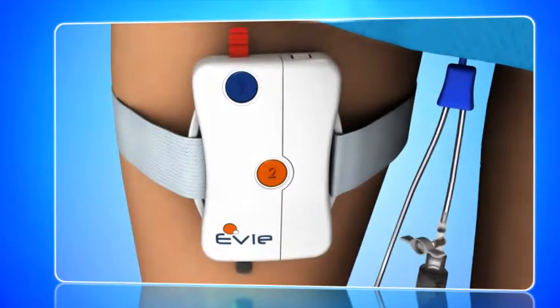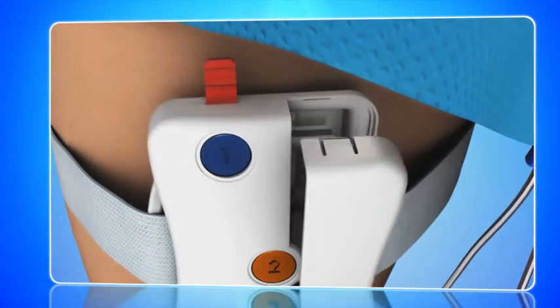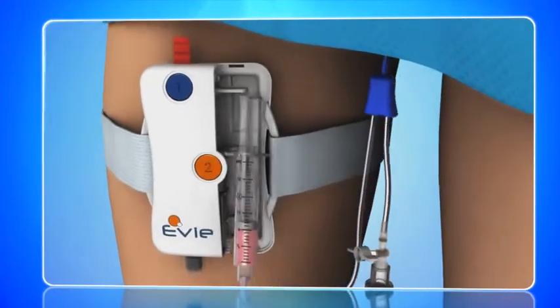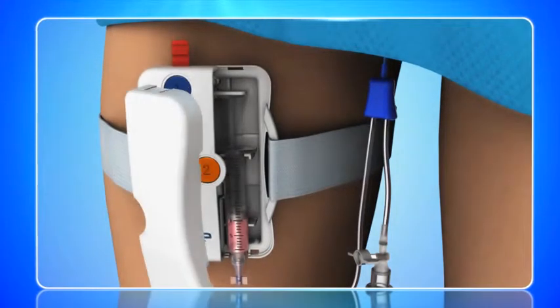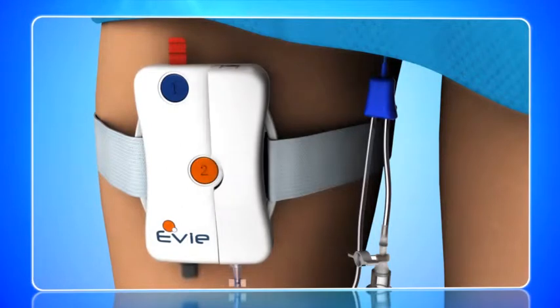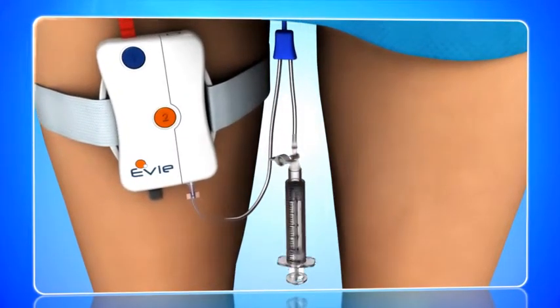Remove the device cover by pressing the release tab at the top next to button number 1. Insert the insemination syringe into the cradle of the device. With the syringe in place, reinstall the cover by first inserting the tab at the bottom before finally locking the tab at the top of the device. Disconnect and discard the balloon inflation syringe.